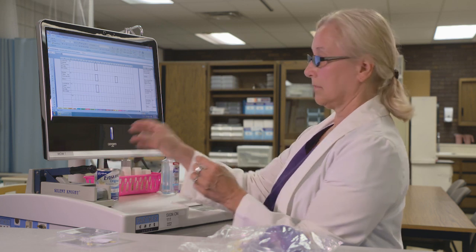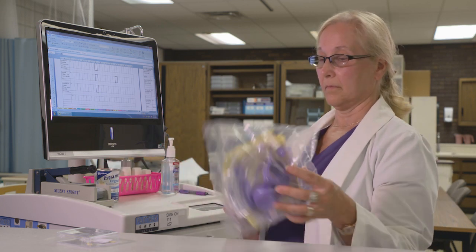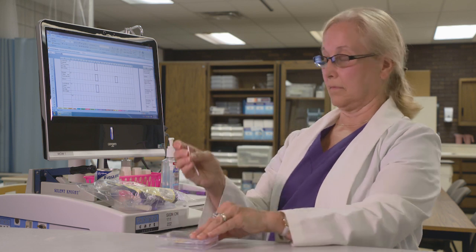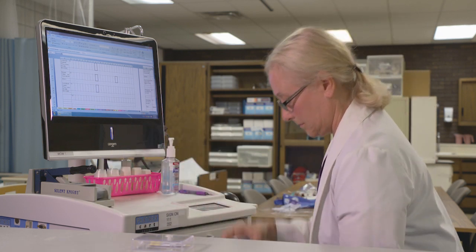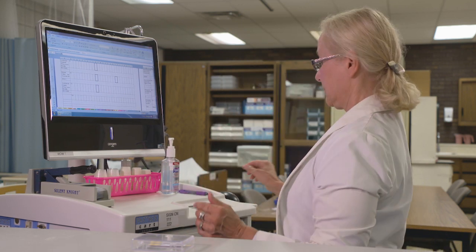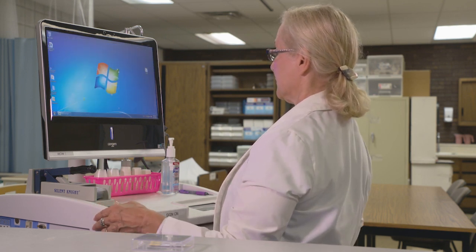Other supplies you must take with you are a feeding bag and a pH strip. The water container and a piston syringe with the irrigation kit will be at the bedside. Other supplies needed are your goggles, clean gloves. The pill crusher will be on the WOW. Minimize the screen before leaving the supply room.